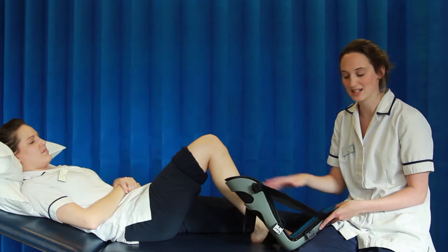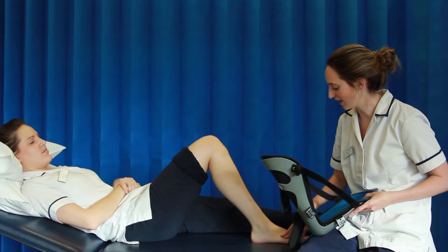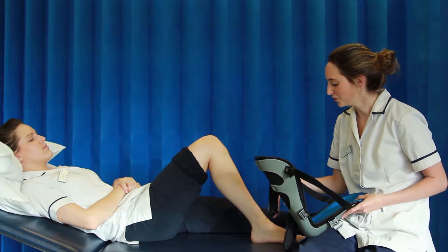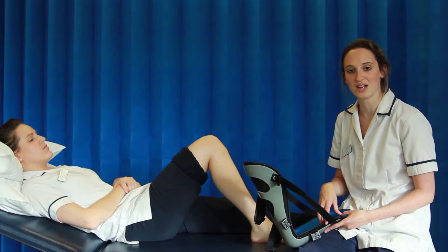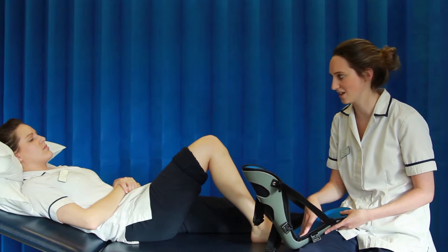A UFO splint is sometimes used for patients after having a stroke to maintain range of movement at the ankle, to prevent the muscles at the back of their leg from becoming tight, and also to prevent any pressure sores from occurring, as this can sometimes happen when a patient is lying in bed for long periods of time.